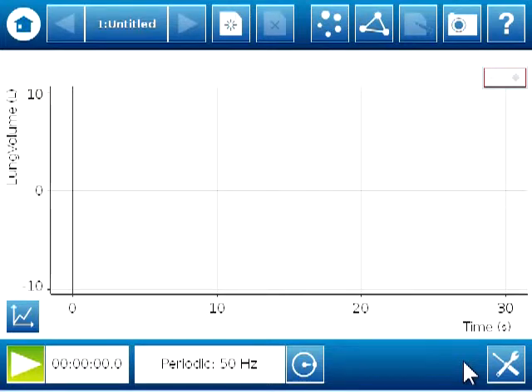So now I'm going to go ahead and collect some spirometer data. The directions for the spirometer use tell you to go ahead and begin data collection with the spirometer mouthpiece resting on the table. So I'm going to do that right now. It's just at rest on the table.